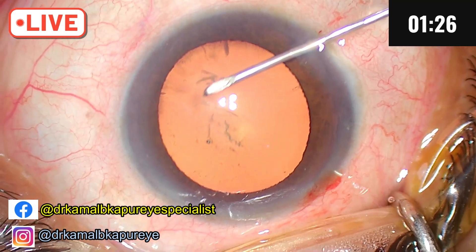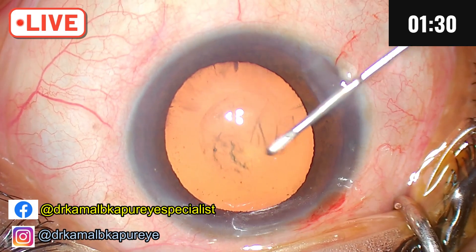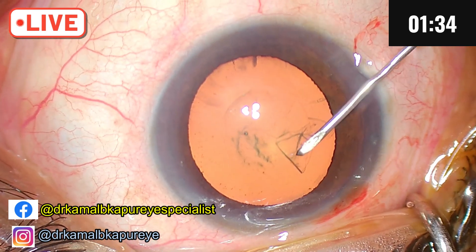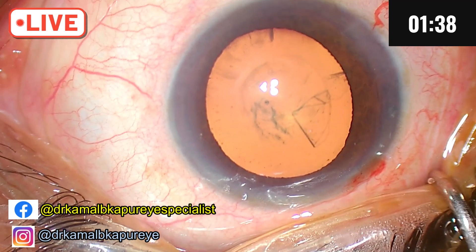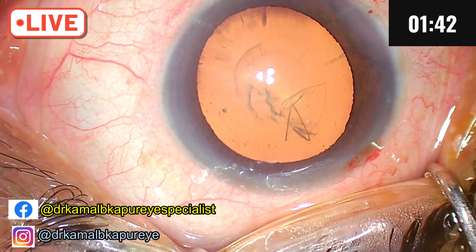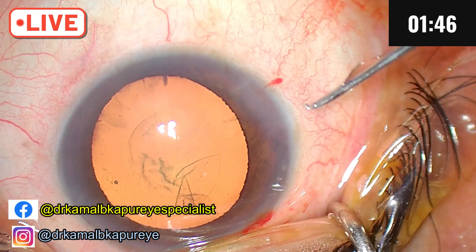The rhexis also has to be a decent size because we want the procedure to be swift. While doing rhexis in patients who have a tendency for chamber shallowing, you have to remember that the needle during capsulotomy is not lifting up the corneal lip, because that tends to make the chamber shallow.